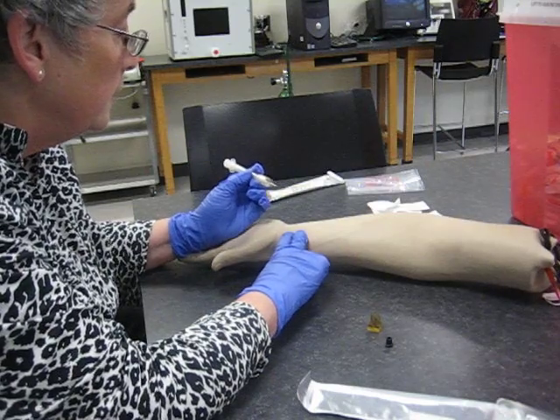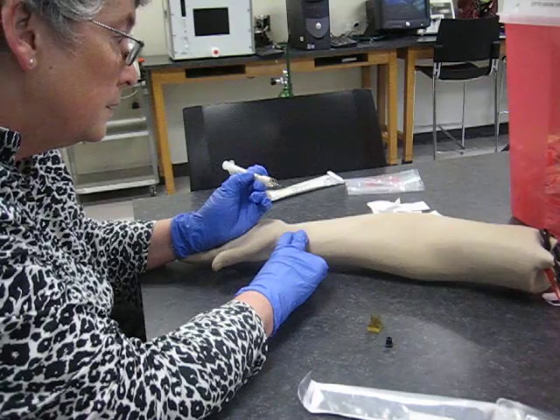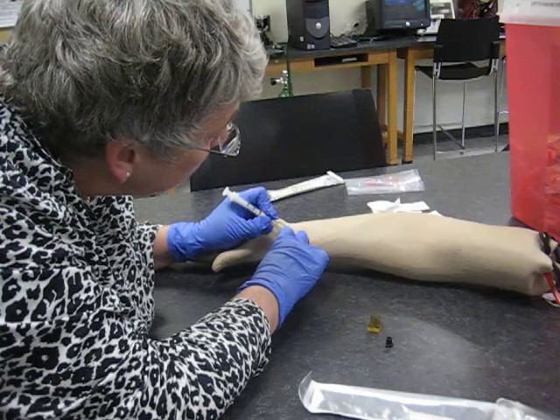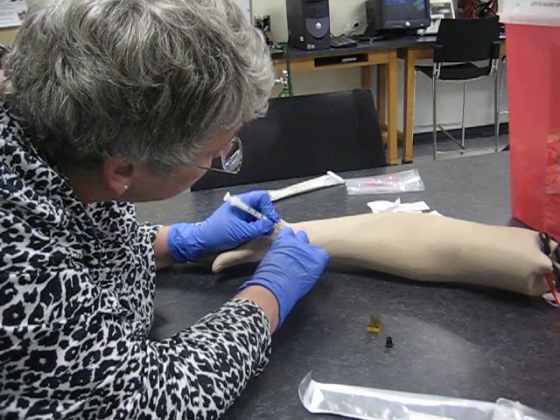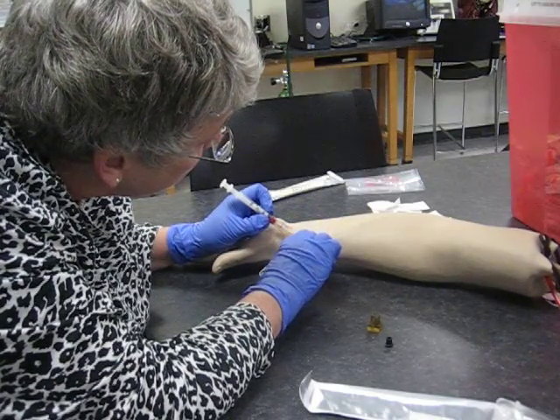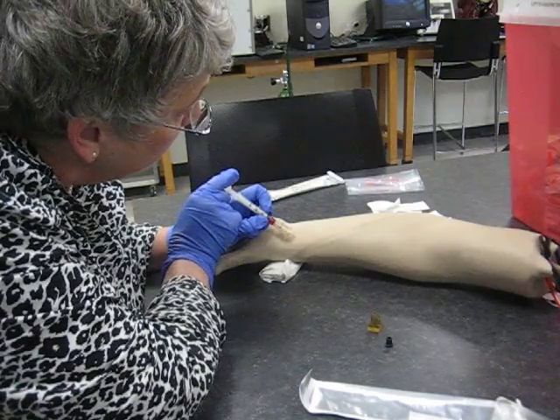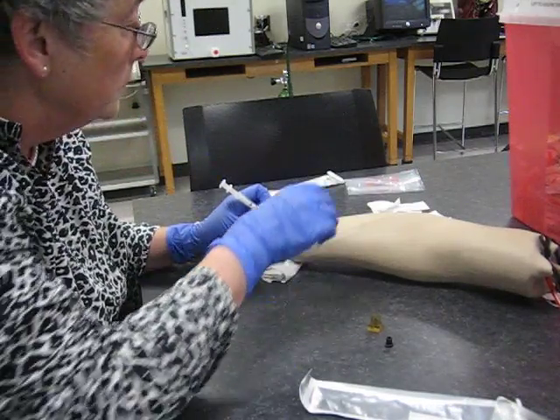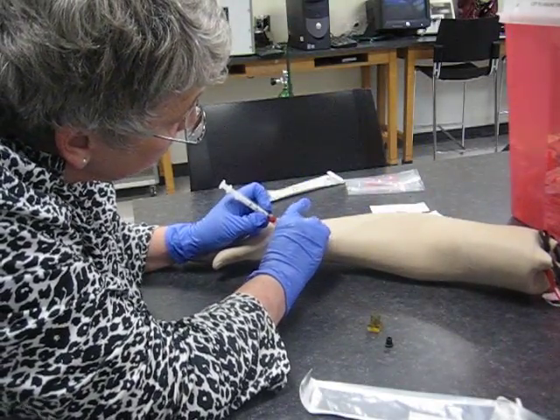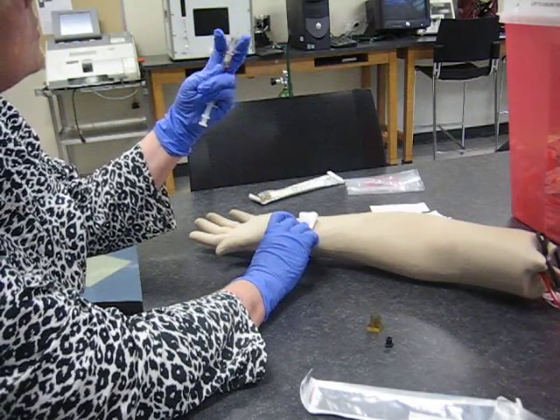Mr. Hand, there won't be a stick until I tell you. Right now I'm looking for it with my fingers again. It's going to be a little stick. Hold still, Mr. Hand, and I'm going to lift my finger up out of the way. Mr. Hand doesn't have real good blood pressure so this may be the best one to get. We want to get two cc's but we may have to make do with this. You pull this up.